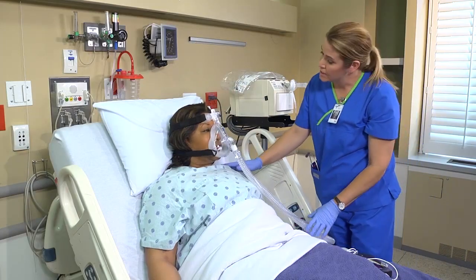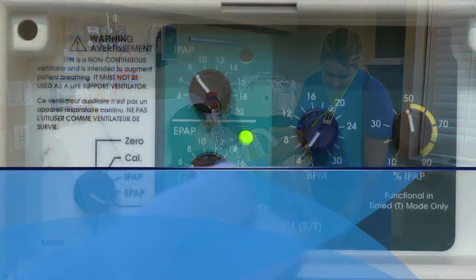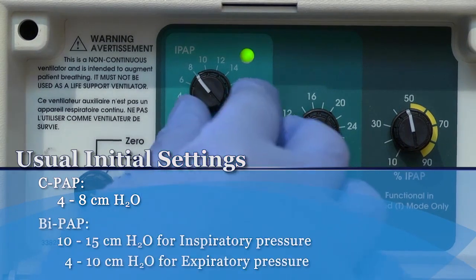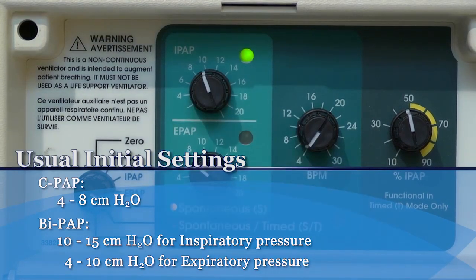Monitor the pulse oximeter reading. Ask her to breathe normally and set the mask pressure as prescribed. For CPAP, the initial setting is usually 4 to 8 centimeters of water. BiPAP typically requires 10 to 15 centimeters of water for inspiratory pressure and 4 to 10 centimeters of water for expiratory pressure.